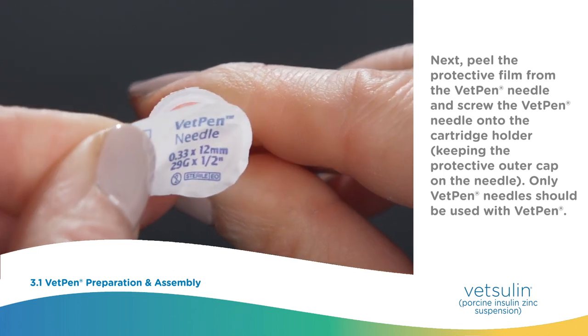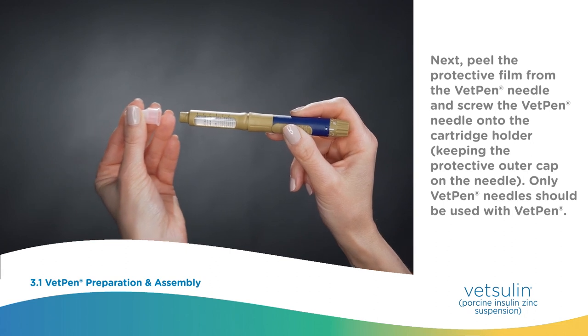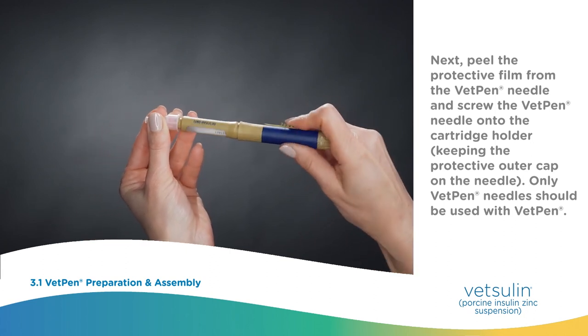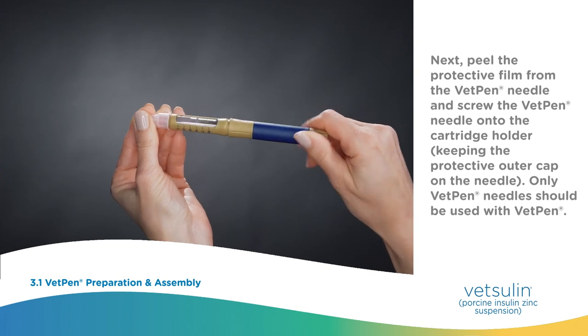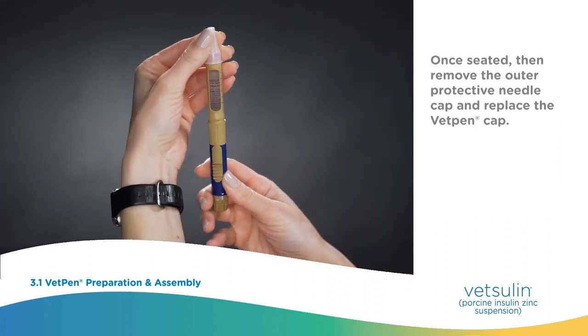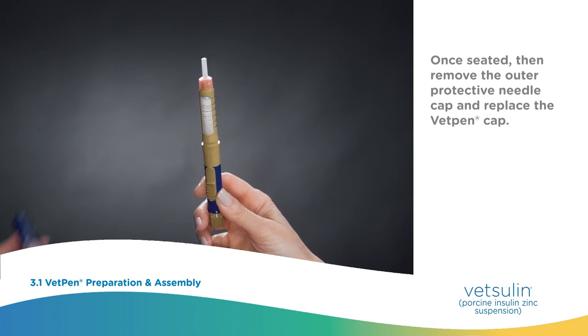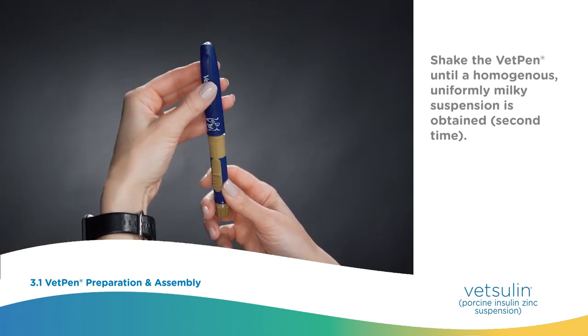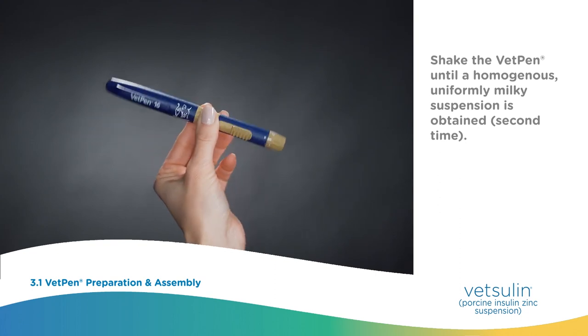Peel the protective film from the VetPen needle and screw the VetPen needle onto the cartridge holder, keeping the protective outer cap on the needle. Only VetPen needles should be used with VetPen. Once seated, remove the outer protective needle cap and replace the VetPen cap. Shake the VetPen until a homogenous uniformly milky suspension is obtained a second time.